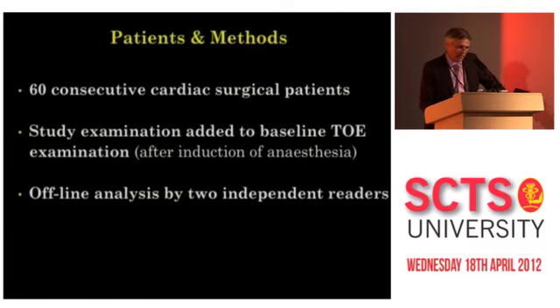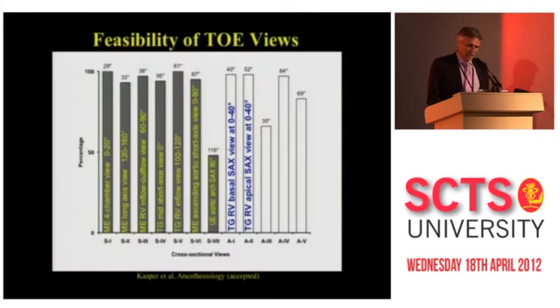So we studied 60 consecutive cardiac surgery patients at the examination after the induction of anesthesia, together with the baseline TOE examination, and performed an offline analysis by 2 independent readers. Here you see the percentage of views obtained in these 60 patients in gray.